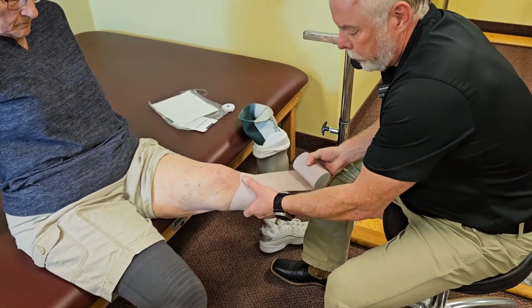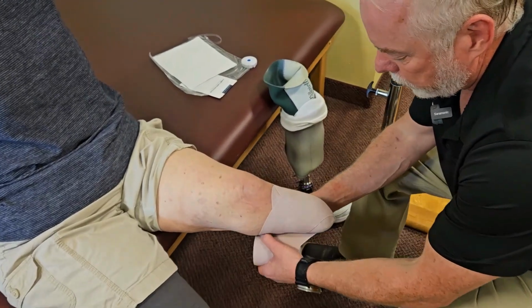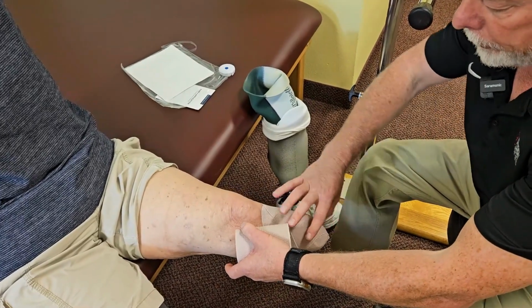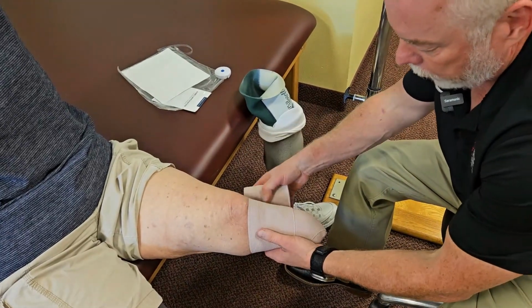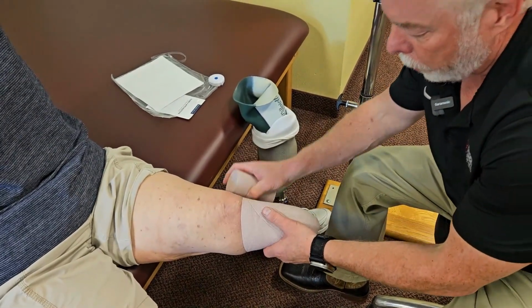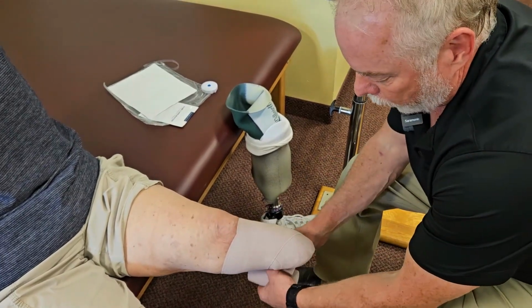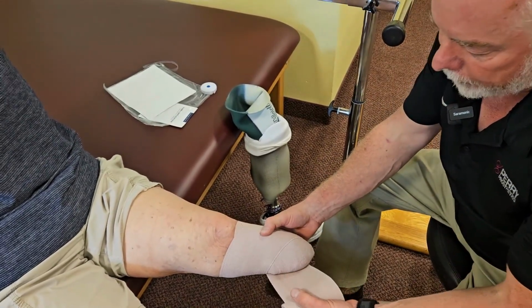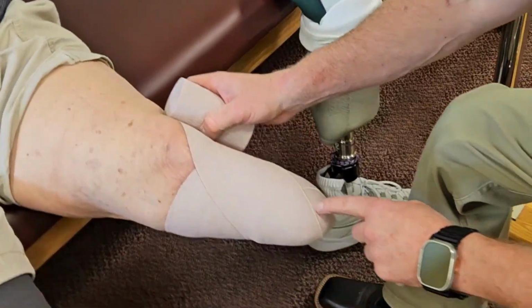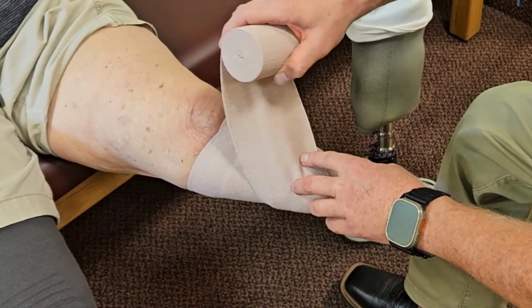I've been doing this since I was 16 because I was wrapping my own limb, so I've really got it down. And I talk about how much compression to take out. My first part is just to get the distal end coverage. Once you've got that good coverage, when you come over right there, I'm taking 50% of the stretch out of the material. As I go around behind their limb, I'm only taking the wrinkles out. I don't want it tight behind the limb. And then as I come back down and go around their limb again, distally, I take out 50% of the stretch. And that's my pattern all the way up.